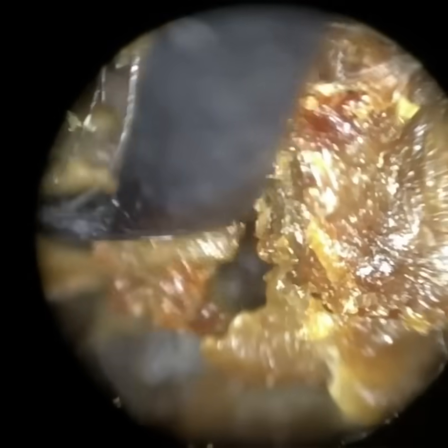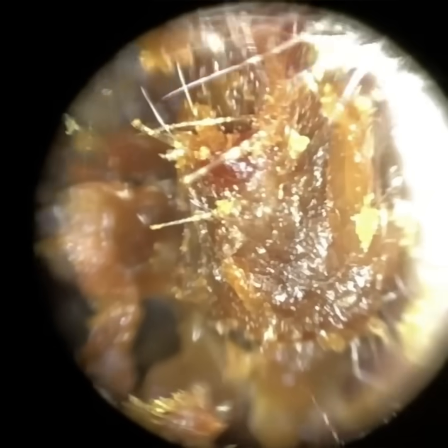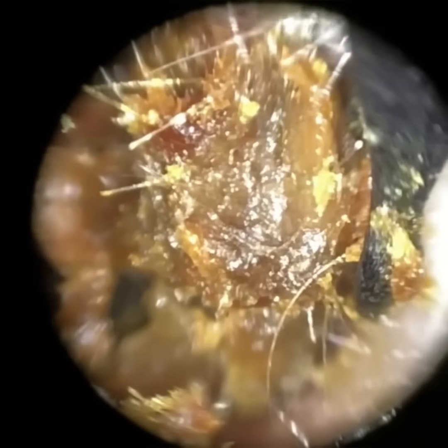However, this patient's got quite a large ear canal, so I'll just use this size up. We do have two additional sizes: a 5mm for large ears and a 5.75mm, and the 5.75mm was mainly going to be for surgically operated ears — for example, patients with mastoid cavities.